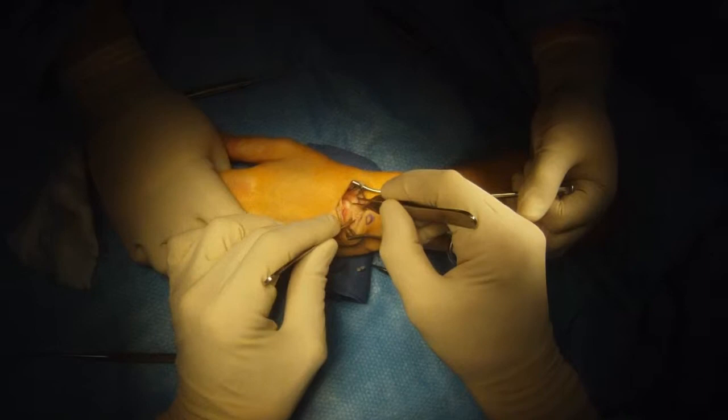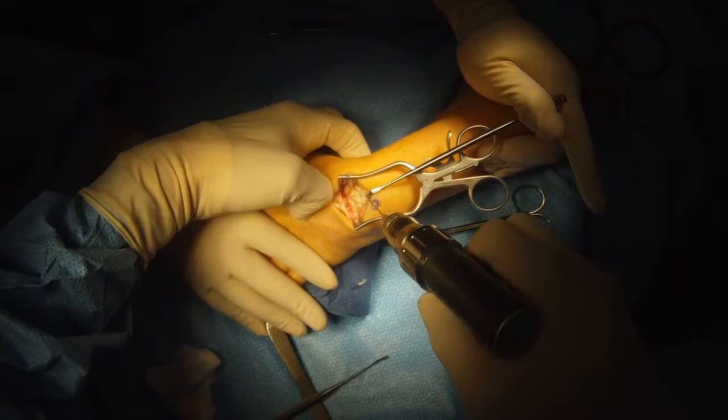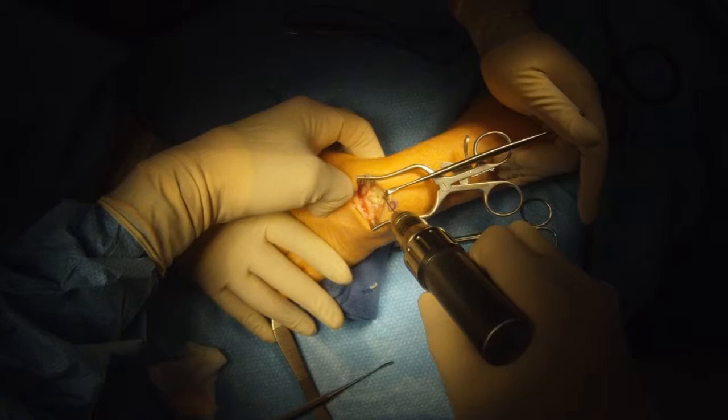Here I'm grasping both the scaphoid and the lunate. The ligament between them is highly lax and there's a great deal of motion between the two — you can move the bones every which way. So we're going to reconstruct the ligament.